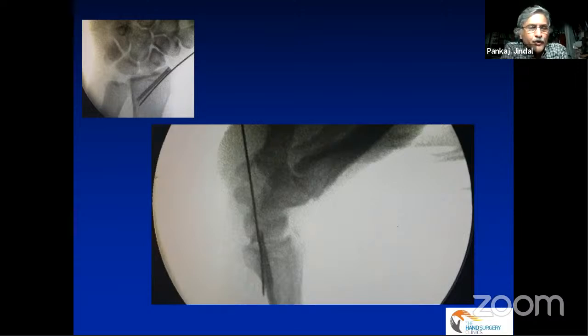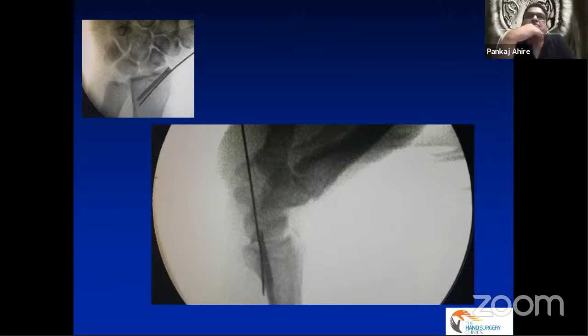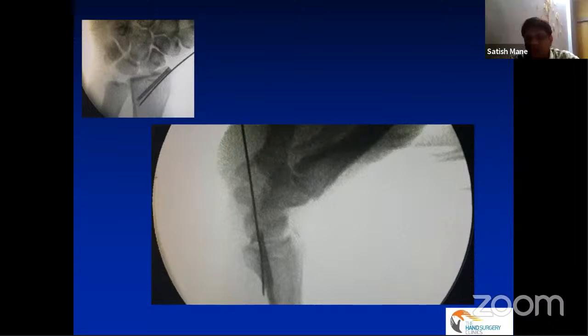So it was not purely ligamentous. It was avulsion of the bone. So because the bone was fixed, the long radiolunate automatically got fixed. So this was done percutaneously, Satish? Yes, sir. Fortunately, the fragment is large and we did it percutaneously, sir.